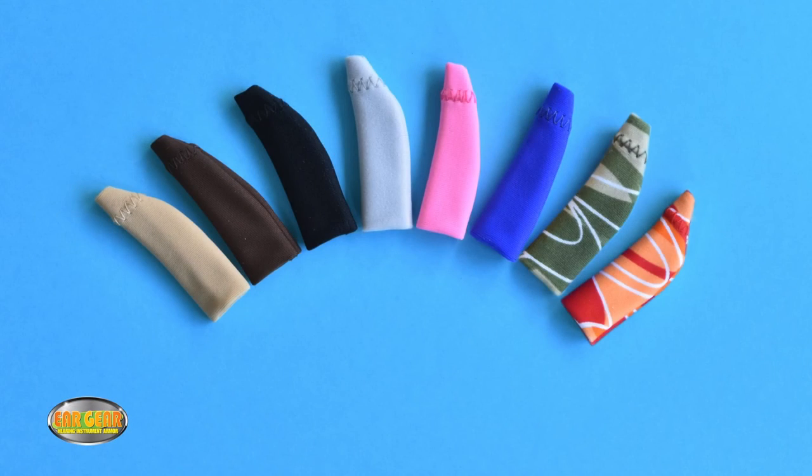Eargear is available in eight colors: Beige, Chocolate Brown, Black, Grey, Lipstick Pink, Royal Blue, Camouflage and Orange Red.